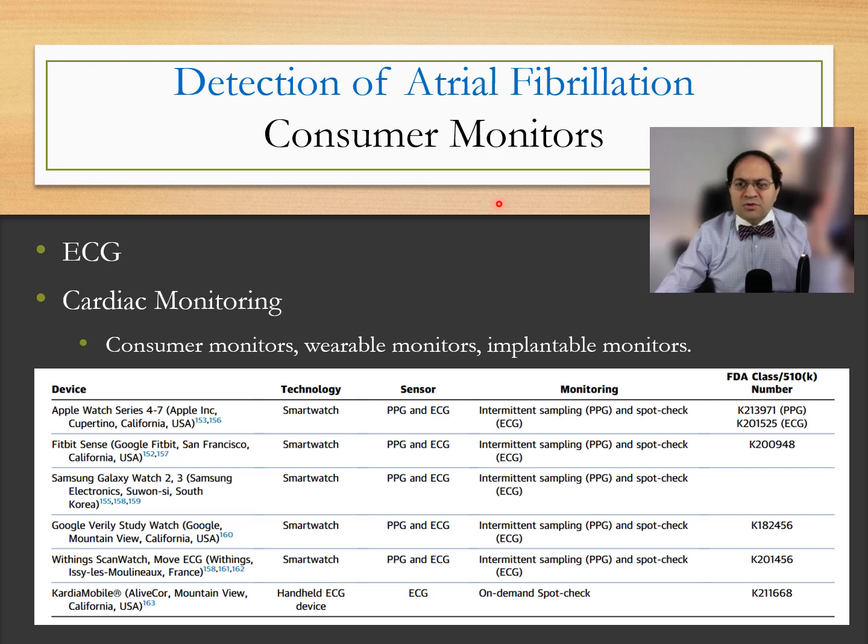The consumer monitors are playing an increasing role in health management these days: smartwatches, chest straps, rings, medical earbuds, even smart clothing. And they basically use 2 methods of identification. One is photoplethysmography, which is an optical technique for reading heart rate and rhythm. And the second one is the usual EKG-based method.